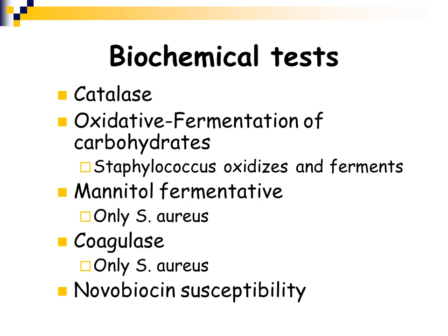Only Staphylococcus aureus is able to ferment mannitol, so you would see that on a mannitol salt agar plate. Only Staphylococcus aureus is coagulase positive, and you can also do Novobiocin susceptibility. We're going to talk about each one of these key tests in the next several slides.